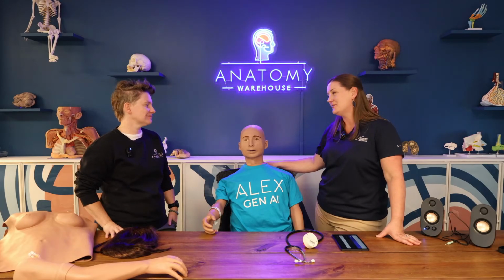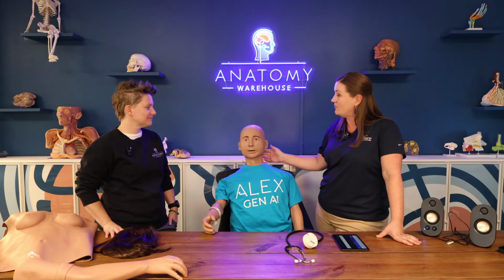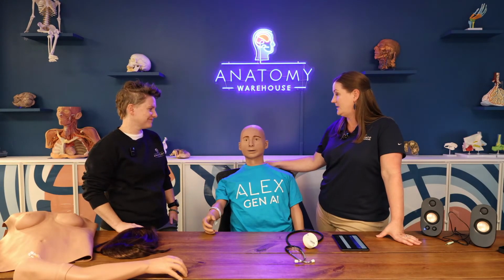I believe so. This Alex has actually been around for a long time, so Alex can absolutely stand the test of time. The hardware warranty is 5 years out of the box. That is a NASCO Healthcare standard, and we will take care of the mannequin for that first 5 years.